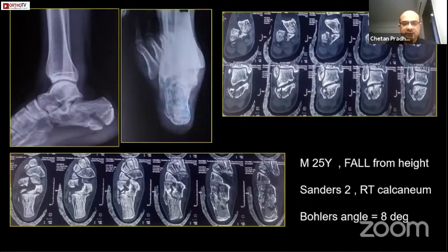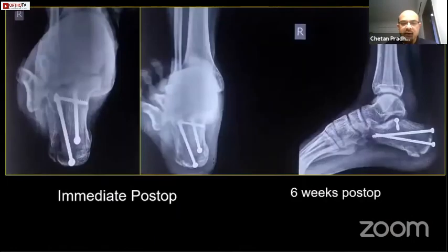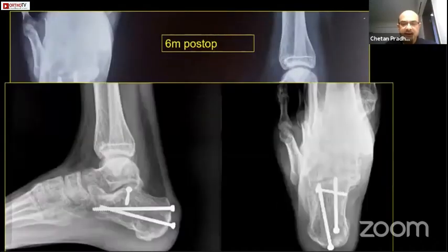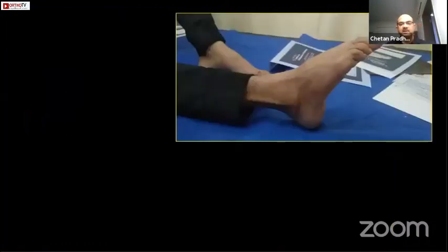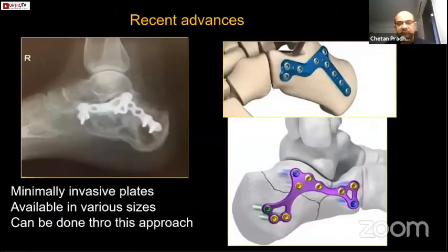This is another Sanders II comminuted case. If you see the joint, it is not bad — this is Sanders II. This is immediate post-op, six weeks post-op, six months post-op, and one year. This is the clinical photo.